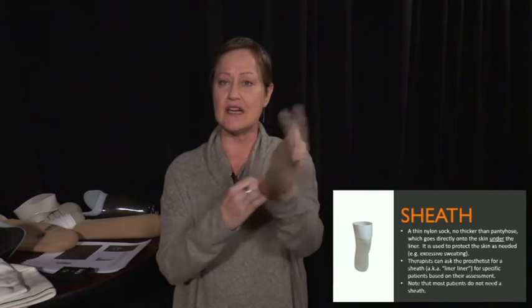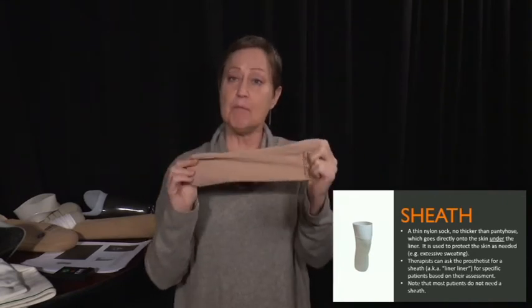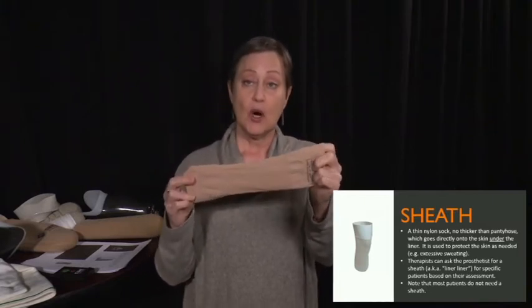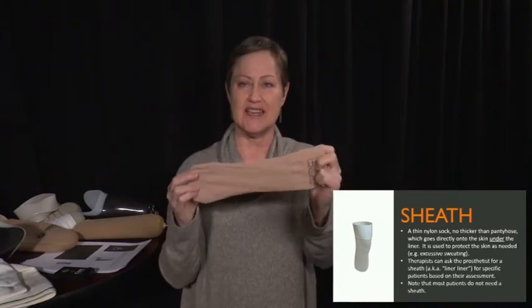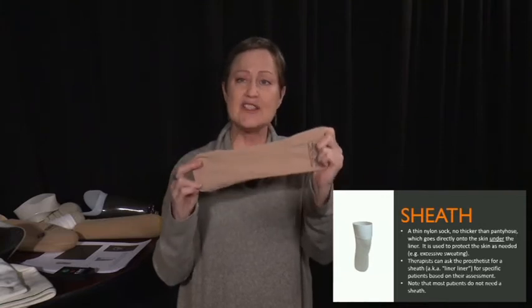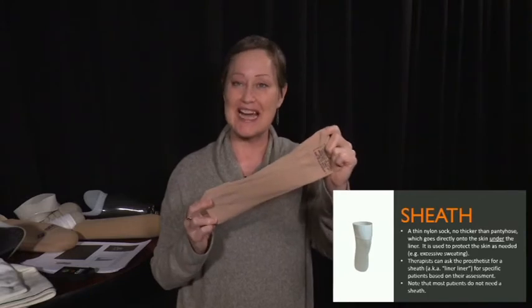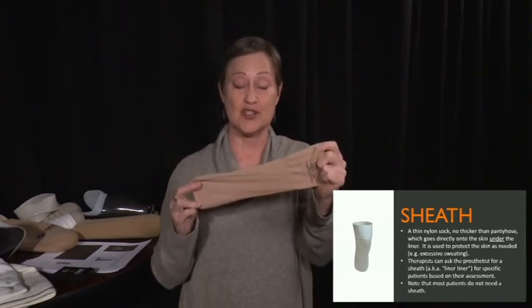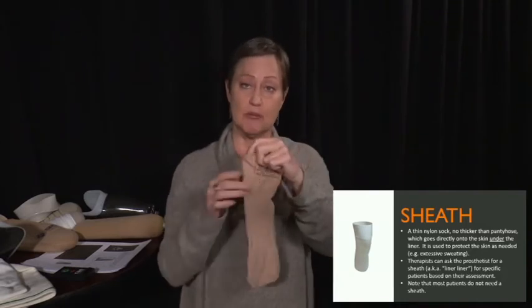It's the thickness of pantyhose, and it's very helpful if somebody tends to sweat a fair amount inside their liner, or if they have any other kind of skin irritation and they don't tolerate the gel or the silicone really well. These are, again, not very often seen, but you can ask for this. The prosthetist isn't naturally going to do a liner or a sheath for every patient. Great conversation to have with your prosthetist.